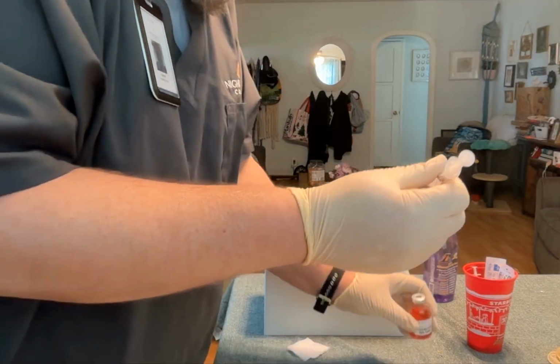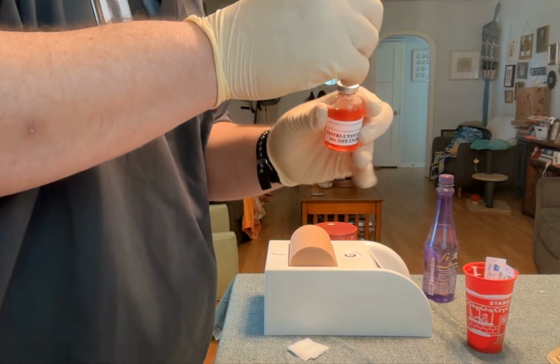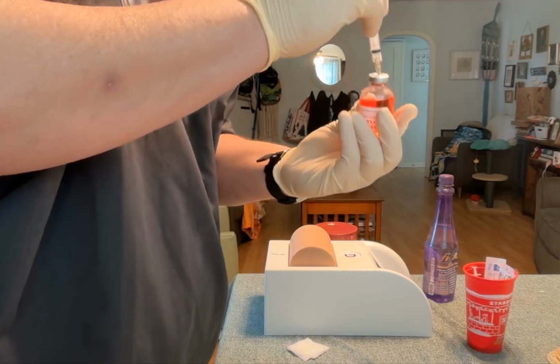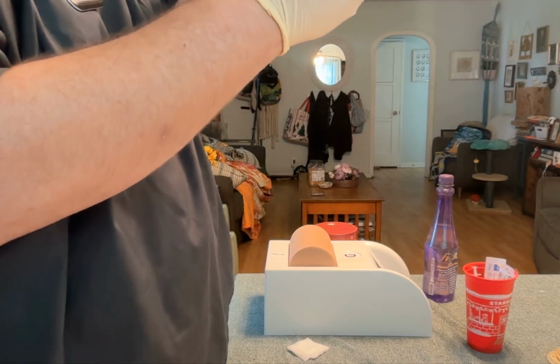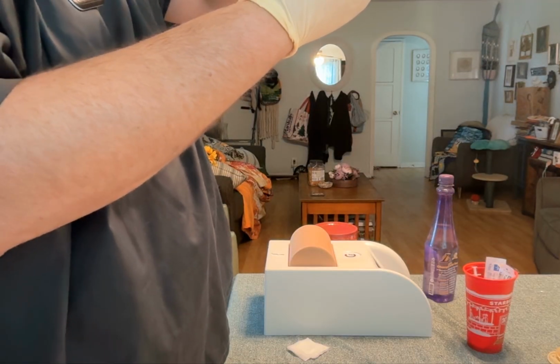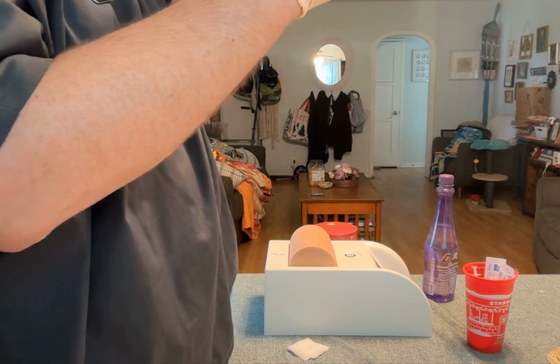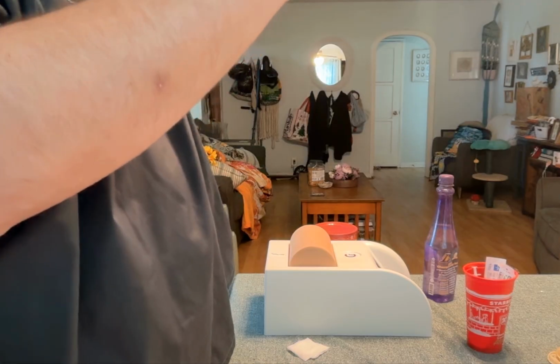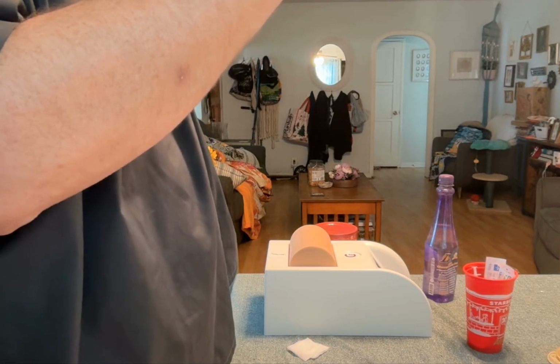And I'm going to inject the air into my morphine, invert the bottle and draw 1.5 milliliters to give me 6 milligrams of morphine. I pull a little bit extra. I see a bubble.